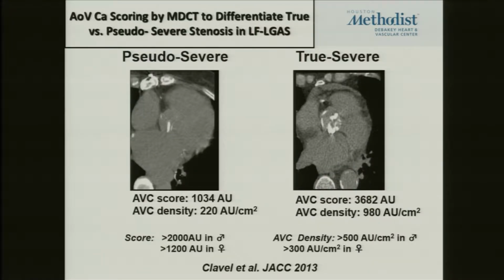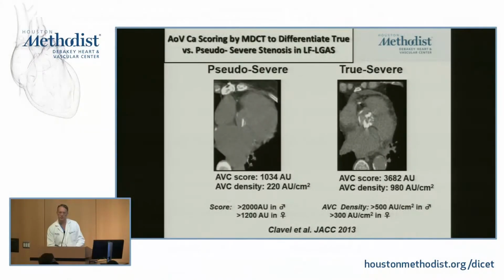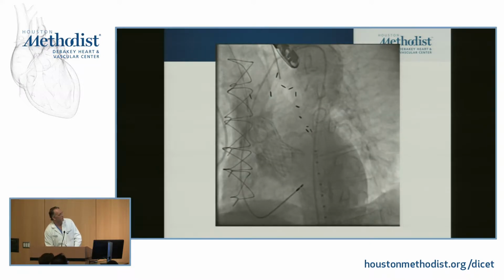So one thing we can use as a tiebreaker is measuring the amount of calcification on the aortic valve, and we use that on a CAT scan here. And so here, you're looking at two separate patients, and this white stuff, that's the calcium. And you can see in this patient, there's a significant degree of calcium, whereas on that patient, there's really minimal calcium. And so if we were faced with a patient like this, and we scanned them, and we see that degree of calcium, we'll be a little bit more confident that this is potentially someone who would benefit from a valvular intervention, which is what he got.